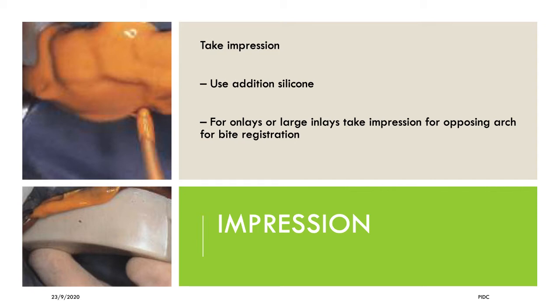In case of digital recording, the intraoral scanner is placed over the prepared tooth. With the help of the intraoral scanner, the prepared tooth is completely scanned around all the surfaces, making sure the occlusion and the contact areas are covered.